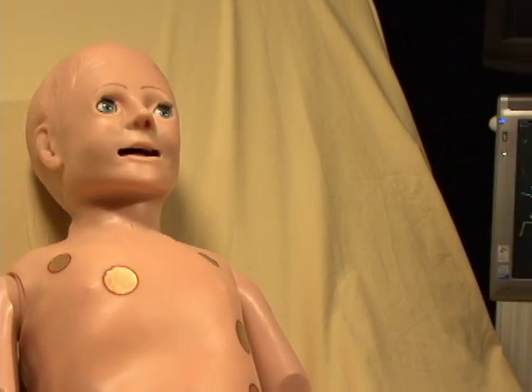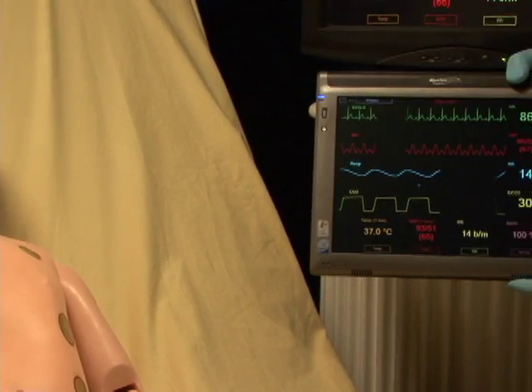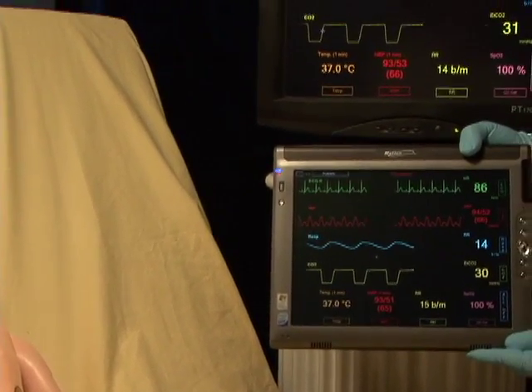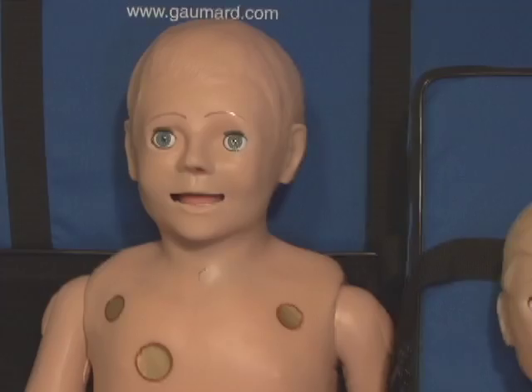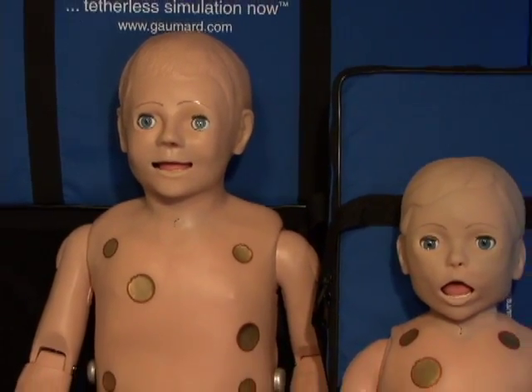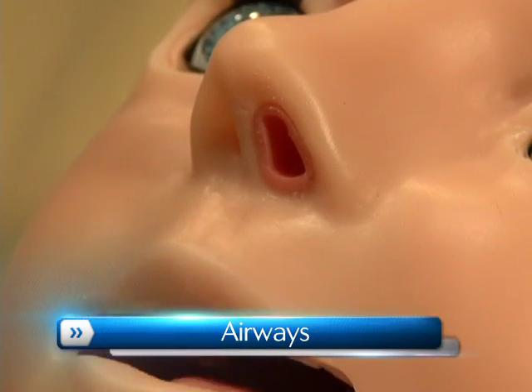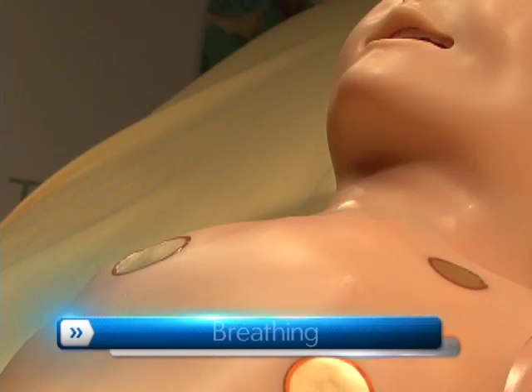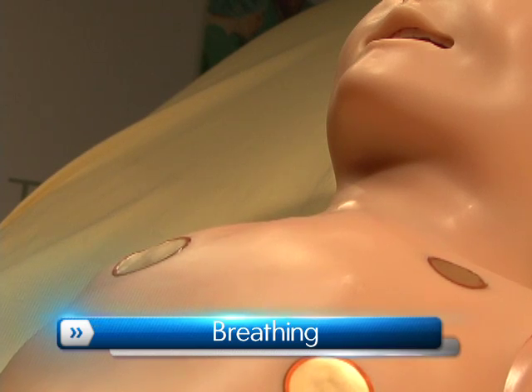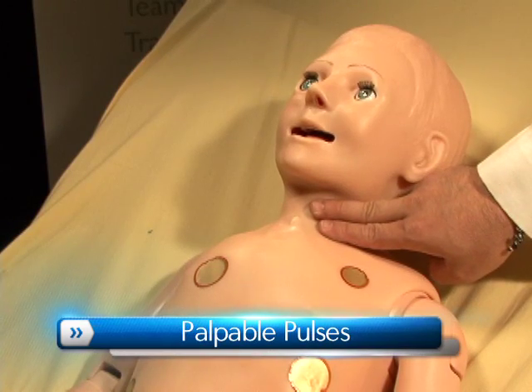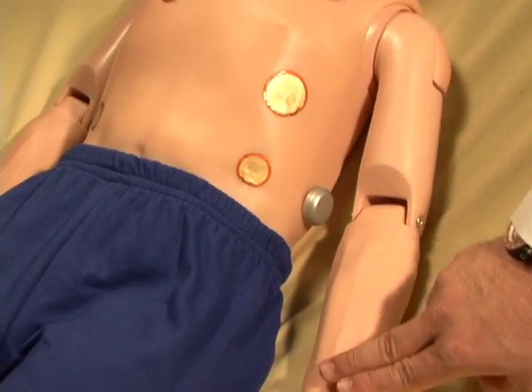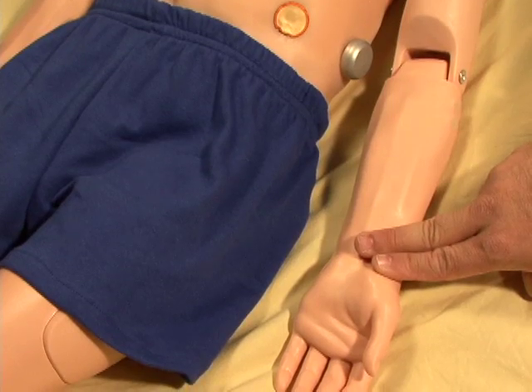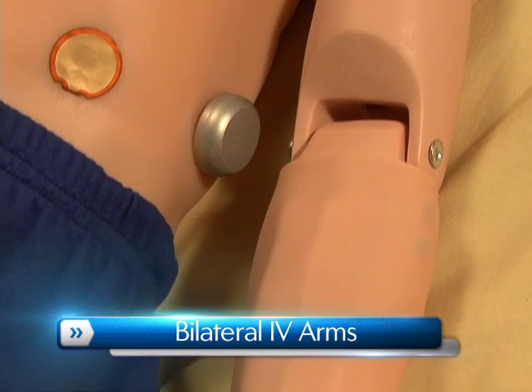For additional realism, virtual vital sign monitors are available in both fixed and mobile formats. Pediatric HAL has many other features such as a realistic airway, breathing, palpable pulses, and bilateral IV arms.